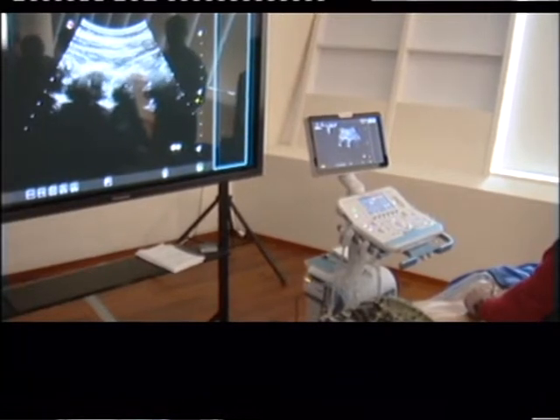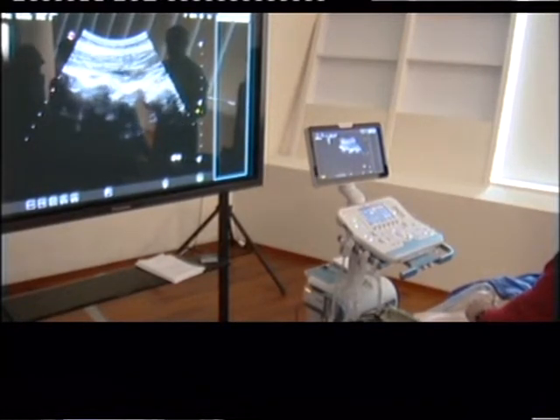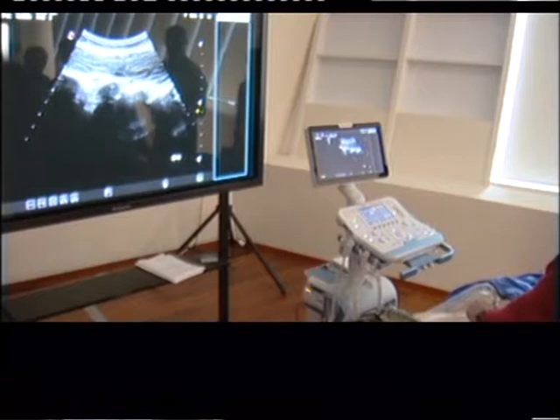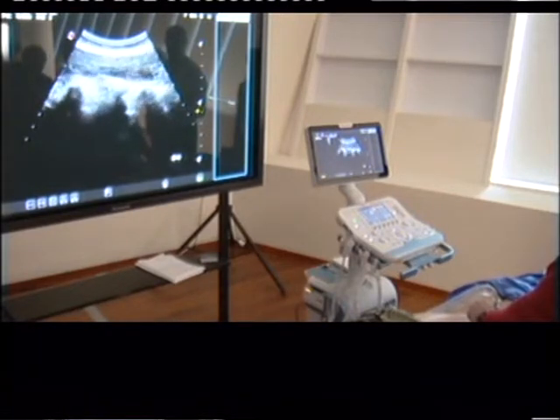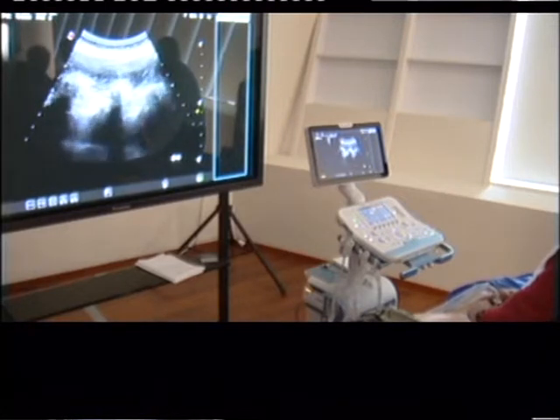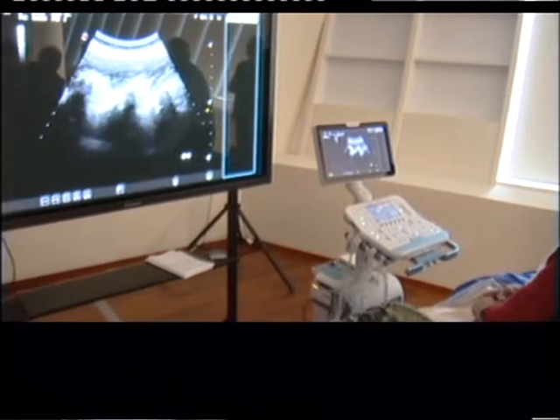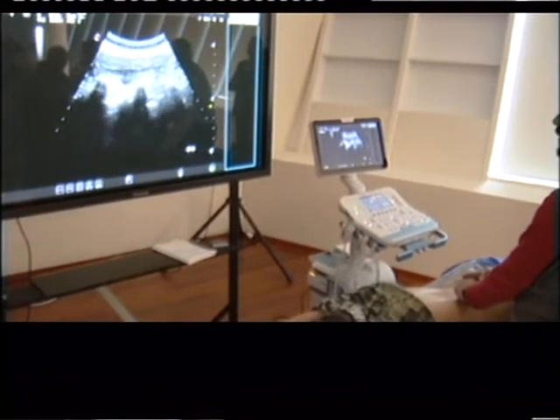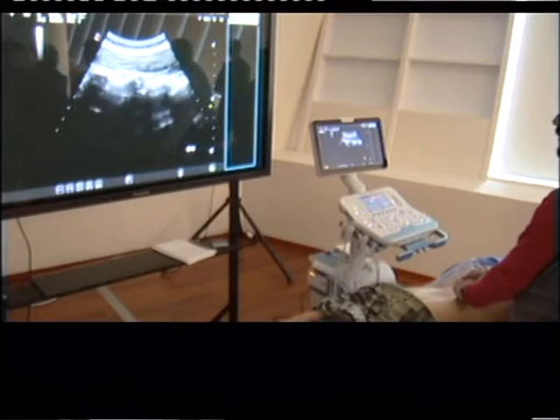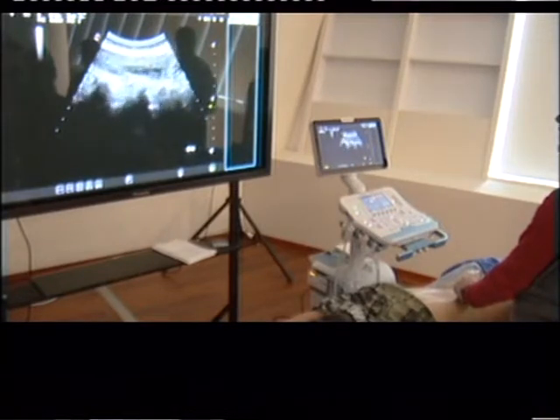Lamina, facets. Keep going, lateral, more lateral, more nerve root. Now think here, like I said before, a little bit out like a tree. Understand? And now transverse process, lumbar plexus. And now you go back to nerve roots, and now facets, epidural canal. Okay?